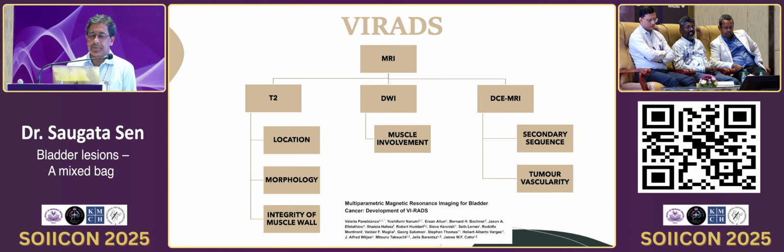It's very simple. What you have to do is based on MR, and it's got 3 sequences. You have a T2, a diffusion weighted imaging, and a contrast sequence. Now, in practice, most of you will not be using MR. Most of us use CT for characterization, for staging of bladder cancer.